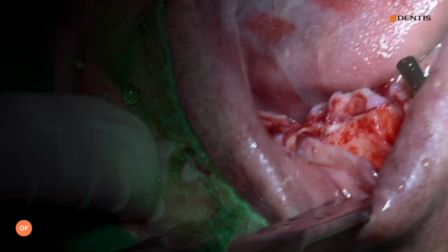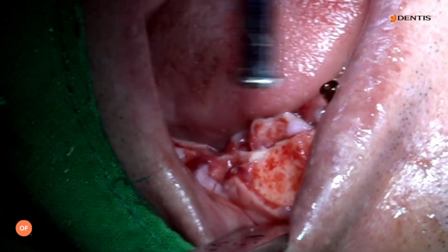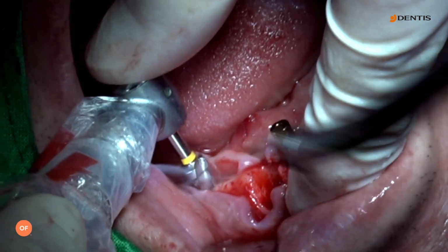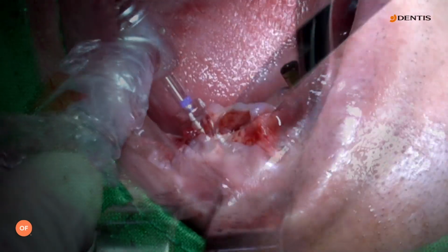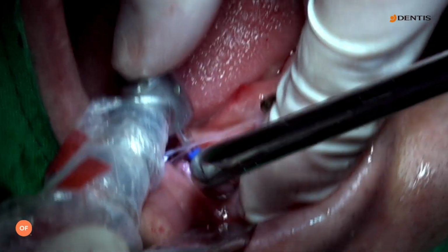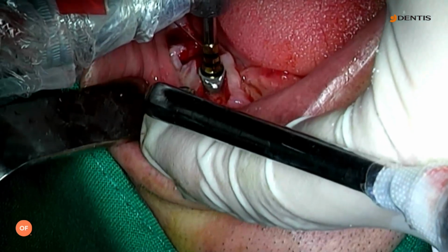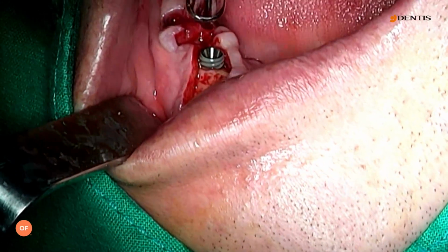Second drill, 3.5. Next drill, 4.0. And then also follow this good angulation, in this manner. Okay. Final drill, 4.5. Keep this angulation in this manner. Okay, 4.5 SQ implant. Okay, keep this angulation. Okay, this is a good primary stability for immediate loading.